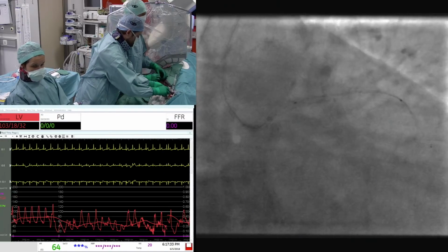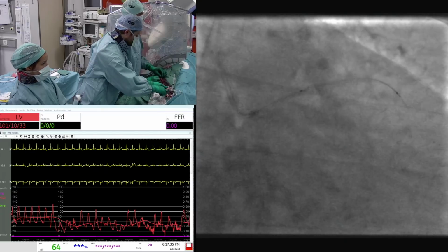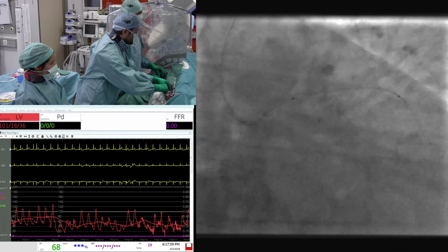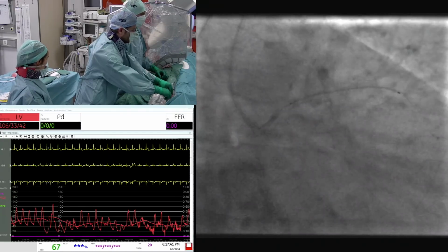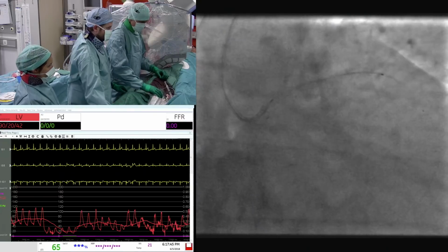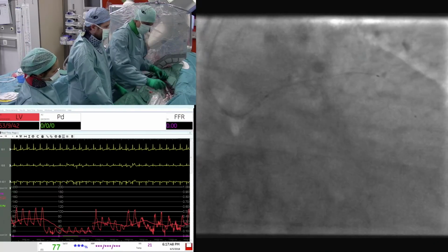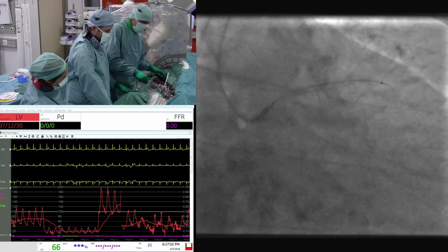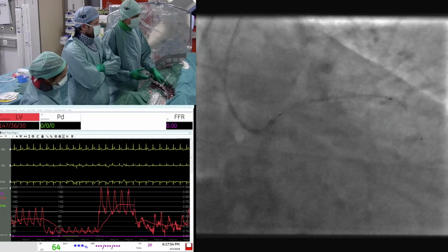So you will position the intermediate marker where the lens is beyond the distal stent, right? Yeah, and by the way, to have a good flush, I also need good intubation of the left main. So we have to be there, but on the other hand, we have to be prudent also, because we know that there is a stent there, and we know that some struts are protruding.